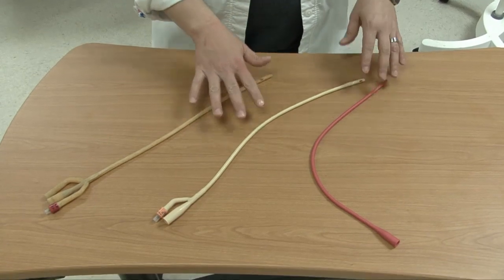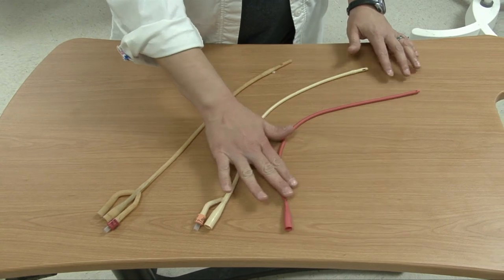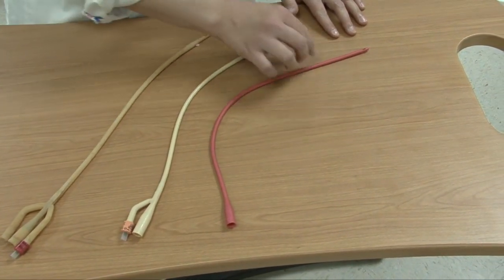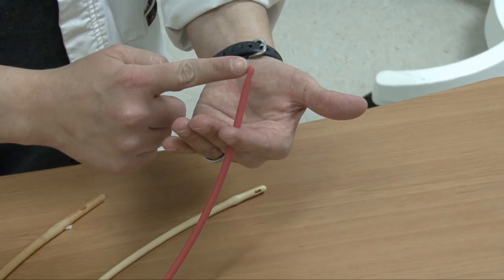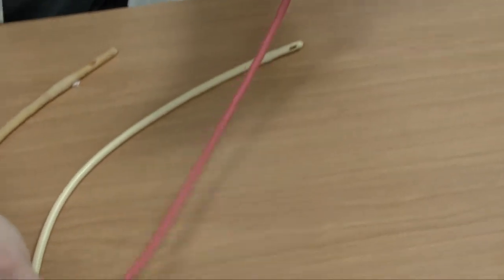As you're looking at these catheters, you're going to see that there are some differences. This first catheter is usually what we call a red rubber catheter. If you look at the end of it, it has a port so that this sits inside the bladder and allows the urine to drain down inside the open hole and come out the other end.